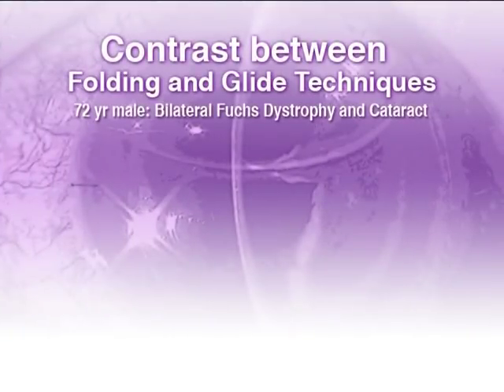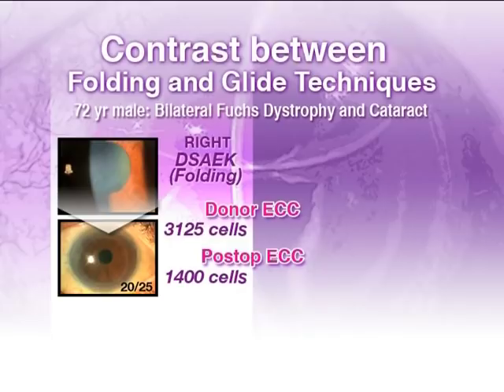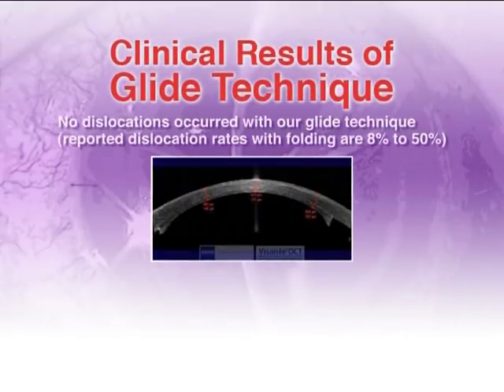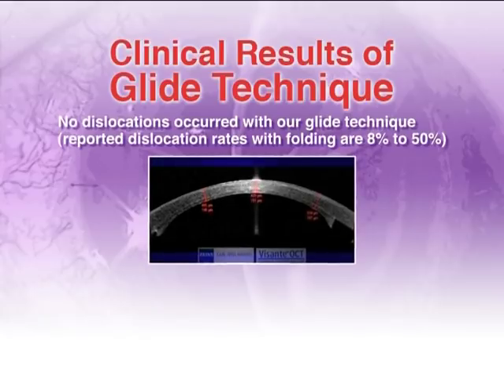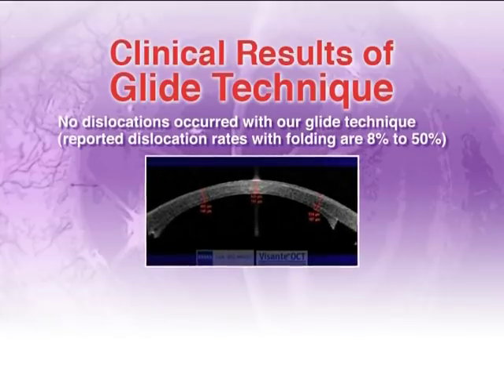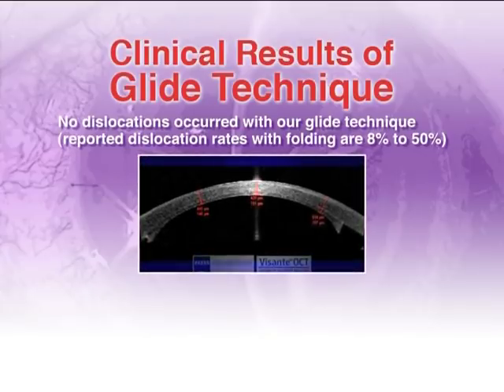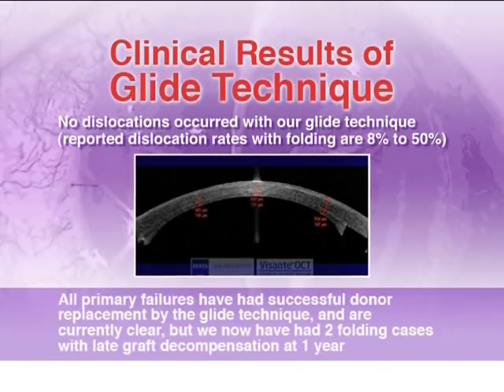This patient had the original folding technique for his right eye, which shows a postoperative endothelial cell loss of 47% with a residual cell count of 1400 cells. In contrast, a subsequent eye which had glide insertion only shows a 19% endothelial cell loss and with a cell count of 2200. We have encountered no cases of donor dislocation in our glide series despite the use of copious viscoelastic, although we initially did have one case of dislocation in our folding series. All of our primary failures have also now had successful graft replacement using the glide technique.